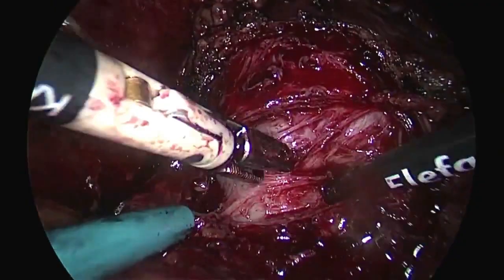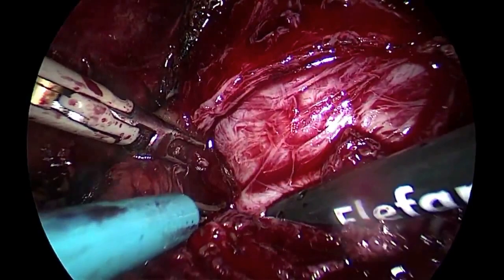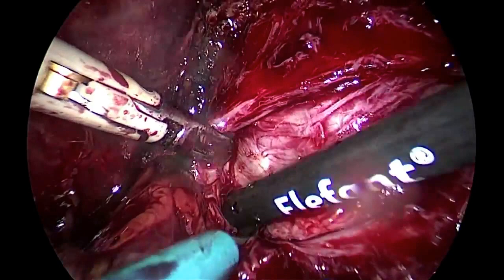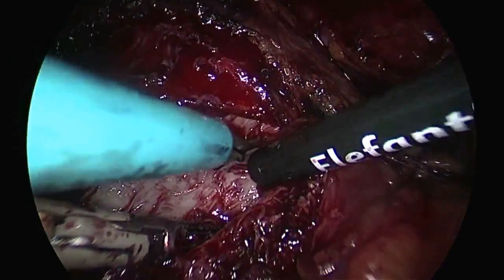I finish to perform my dissection when I look at the bottom of the prostate, of the adenoma, okay? Perfect. And that is perfectly white, as you can see.